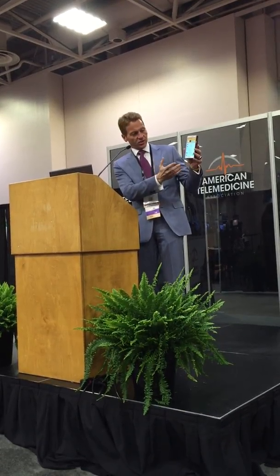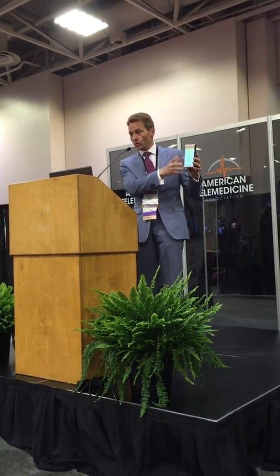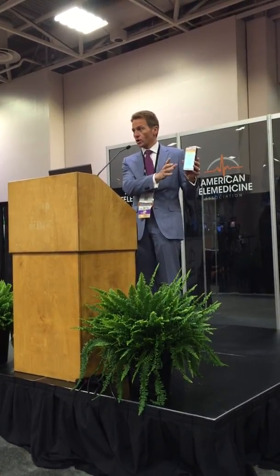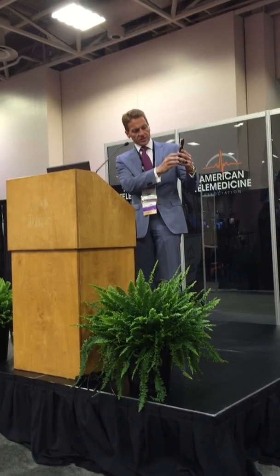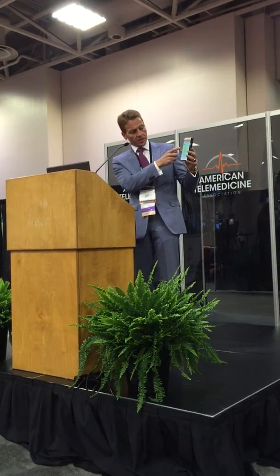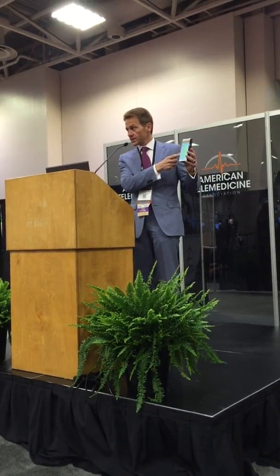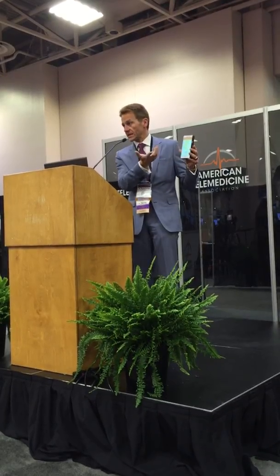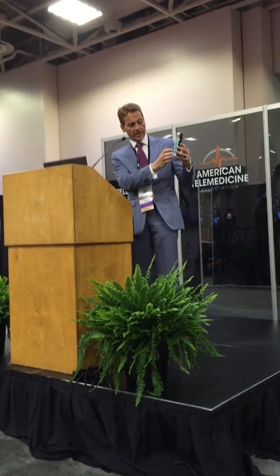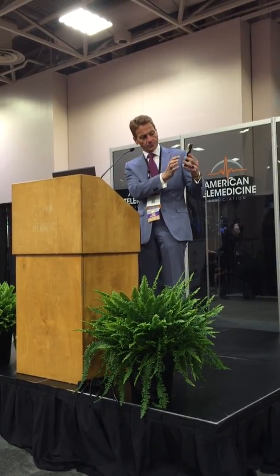Now, to see how it looks, I apologize that I cannot show you better. Everything is text message based here. You do not require a data plan, and it will also work if there's no mobile internet available. You receive a message that says who sent the alarm and when, information about the person which may be required by an ambulance, such as allergies, medication taken and medication required, basically insulin, that's the most likely case. Down here the receiver gets a link and presses it.